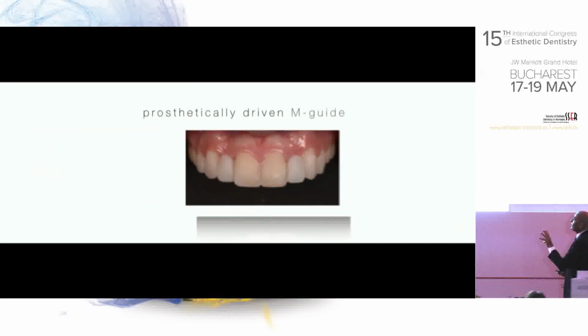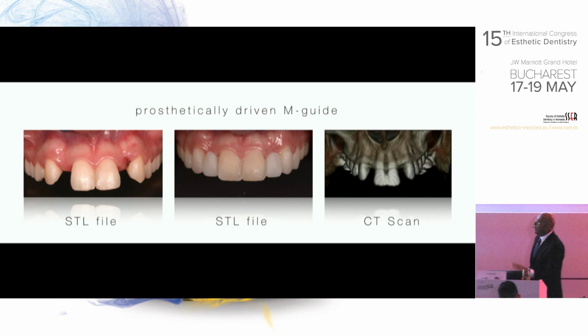So with this, now I will send this case for a guide. Let me tell you something. Even though I'm working with the best implantologists on earth, Puyo is one of them, Nicolescu, Eric Van Doren is another one, Junaid is my surgeon, we have worked together for 30 years, still I can tell you that they all use a guide.